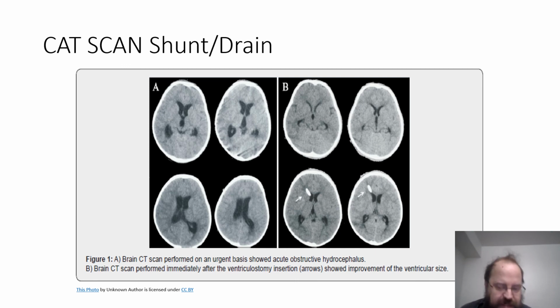But if I'm looking for detail, neurophysiology, high levels of resolution, a CT scan is not your choice, and it won't show you why you're having problems speaking or trouble with spelling or thinking or any of those things, unless it is due to an acute emergency problem that can be fixed right away. If it's something more subtle, then you need to turn to the MRI or even the SPECT or the PET scan.